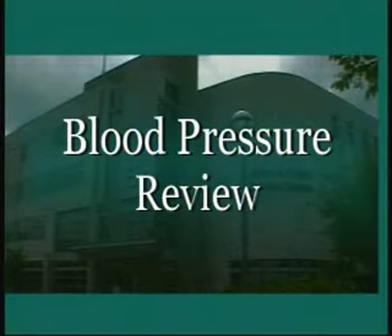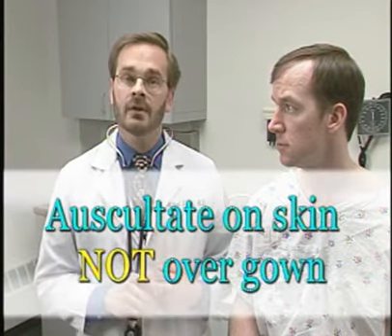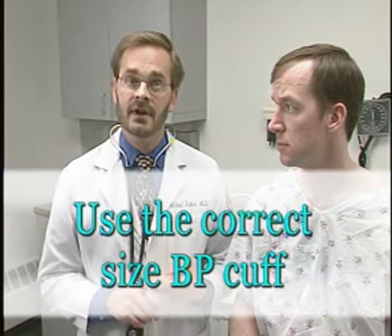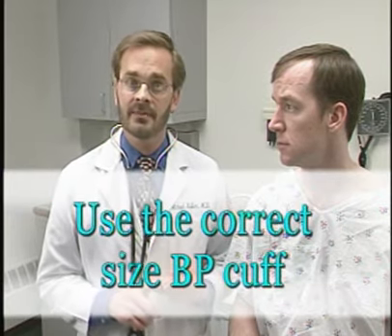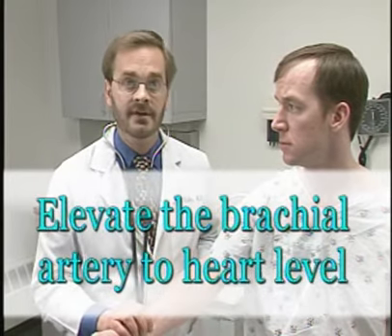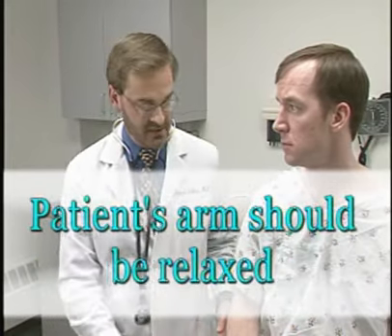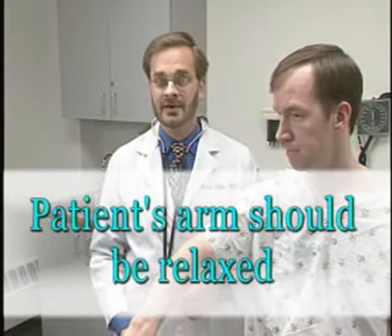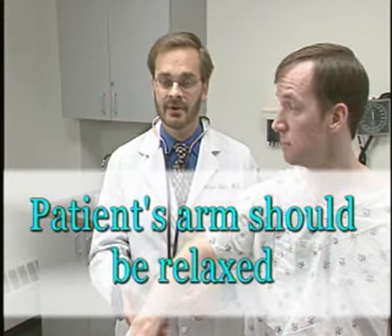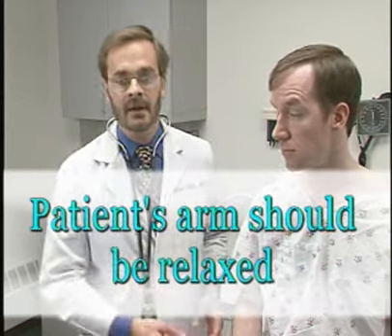So let's finish up with blood pressure by reviewing some of the common errors in assessing blood pressure. First, again, checking the auscultation over an article of clothing or a gown is incorrect. Second, using a cuff that's too small will falsely elevate blood pressure. Third, not elevating the arm or the brachial artery to the level of the heart would cause an error. Fourth, if the patient just held their arm up themselves, they'd be contracting their muscles, and that would falsely elevate blood pressure. So again, you as a physician need to help elevate their arm to heart level.